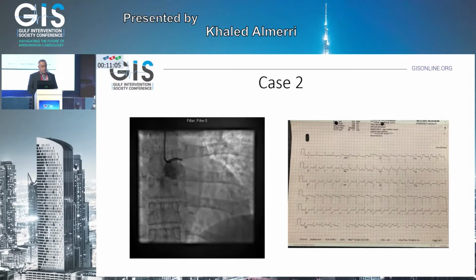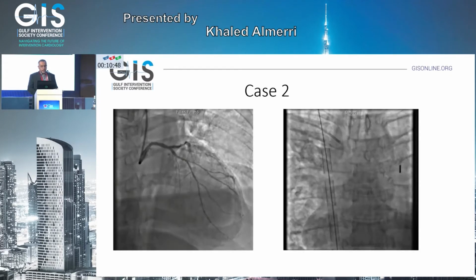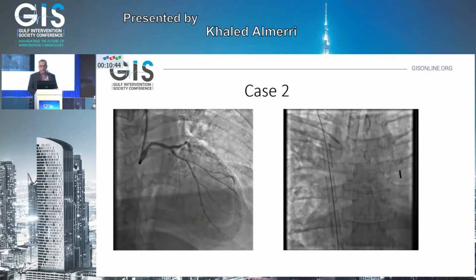The other patient had an acute total occlusion of the left main with no flow into it, and he presented with ST elevation and again AVR ST elevation. And the LV function, as expected, is really poor here. Despite opening the left main, he received an intra-aortic balloon pump, and that was not enough due to arrhythmias and persistent shock. Then you can see an ECMO was inserted.